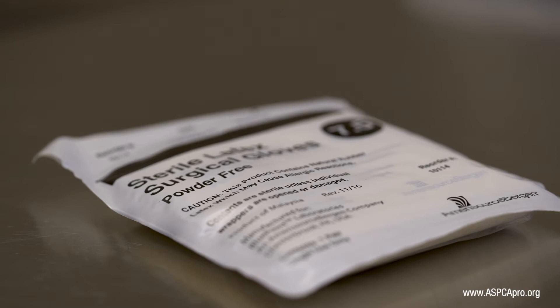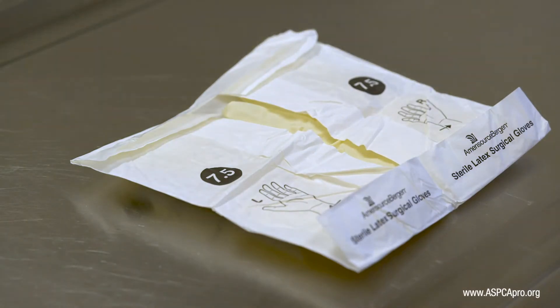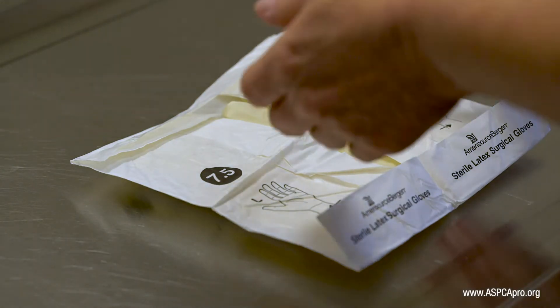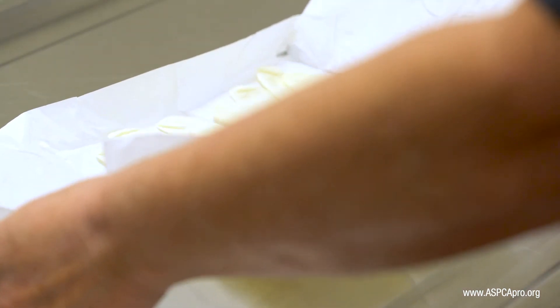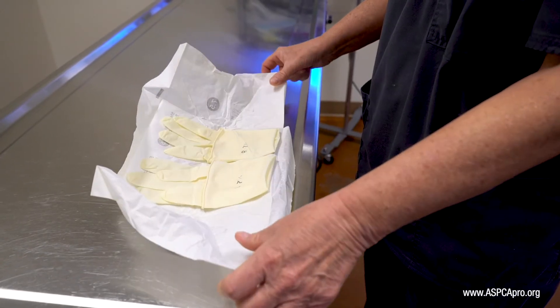Performing open gloving with good technique ensures sterility. To begin, carefully open the glove pack. Some surgeons prefer to fold the paper edge nearest to them underneath, as this helps keep it open.